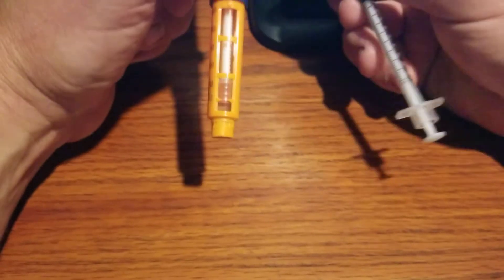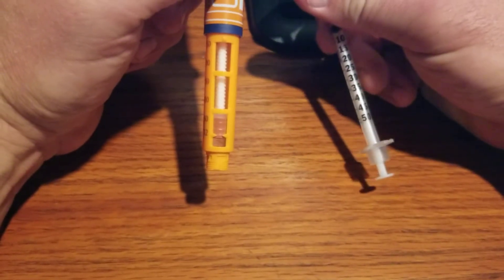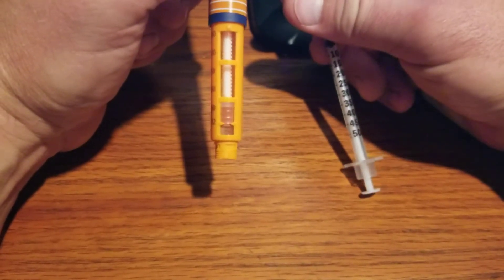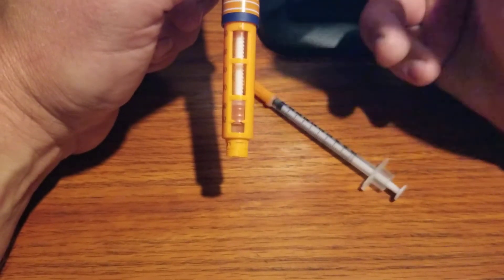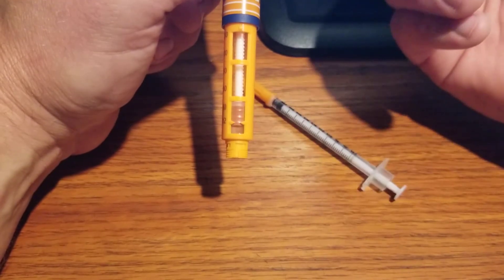The key is you have to inject air into the insulin pen in order to get that last little bit of insulin out. Otherwise it creates a suction and you never get that last little drop.